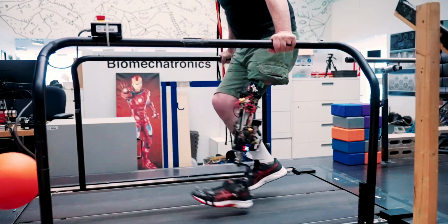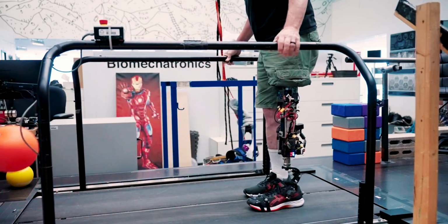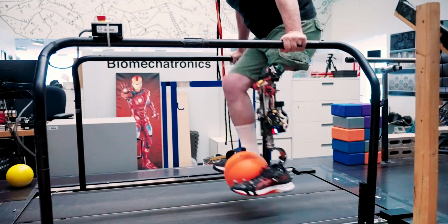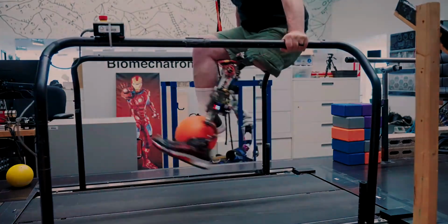In the video, you can see a patient, with just a few inches of upper thigh and femur connected to the new prosthetic limb, demonstrating motion that's surprisingly fluid as they walk and kick a ball.